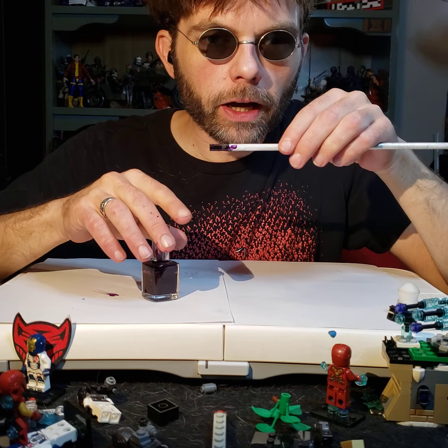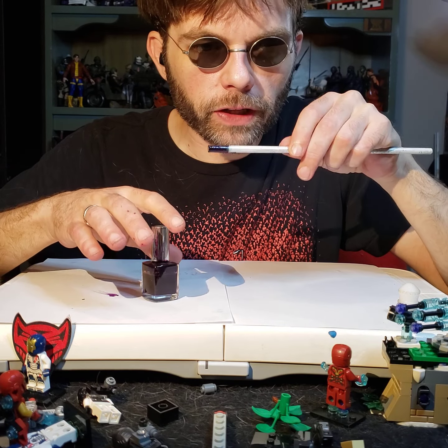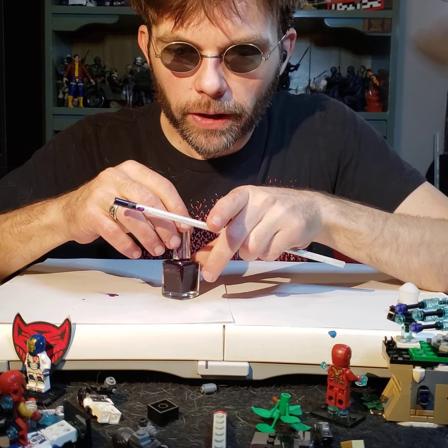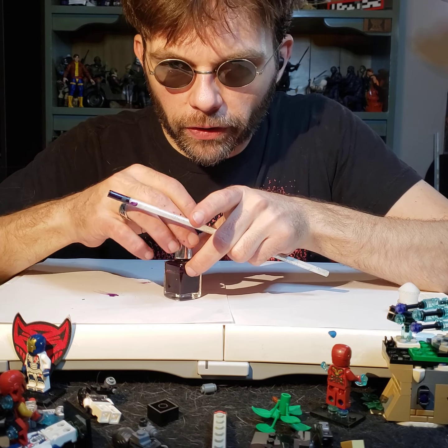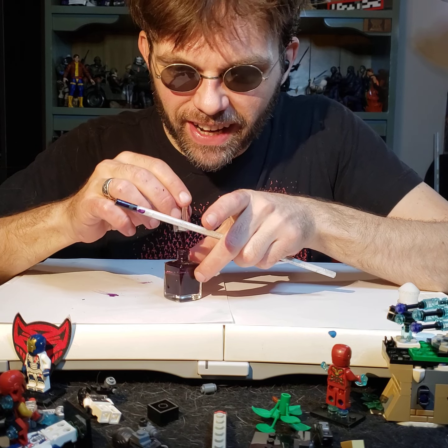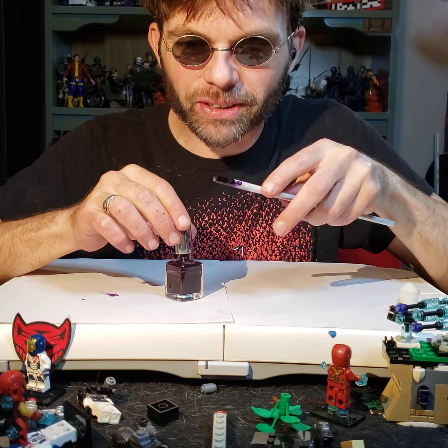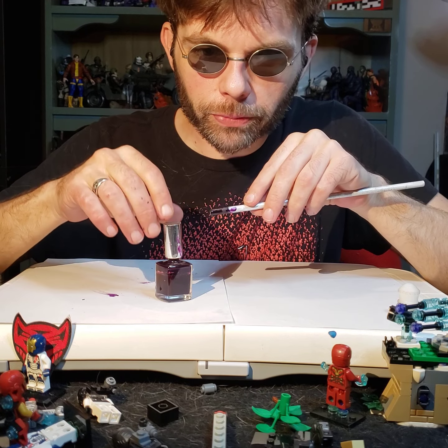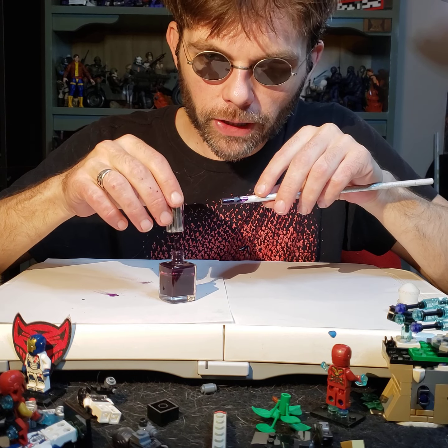I hear about women blowing on the nail polish, so I think it works. Why wouldn't it if they didn't do it? I don't handle nail polish very often, so it's going to be messy. It's going to be messy for sure. It's a messy job when you're doing this as a blind person, so I do advise, if you want to, wear gloves, but I don't like wearing gloves, so I don't wear gloves.